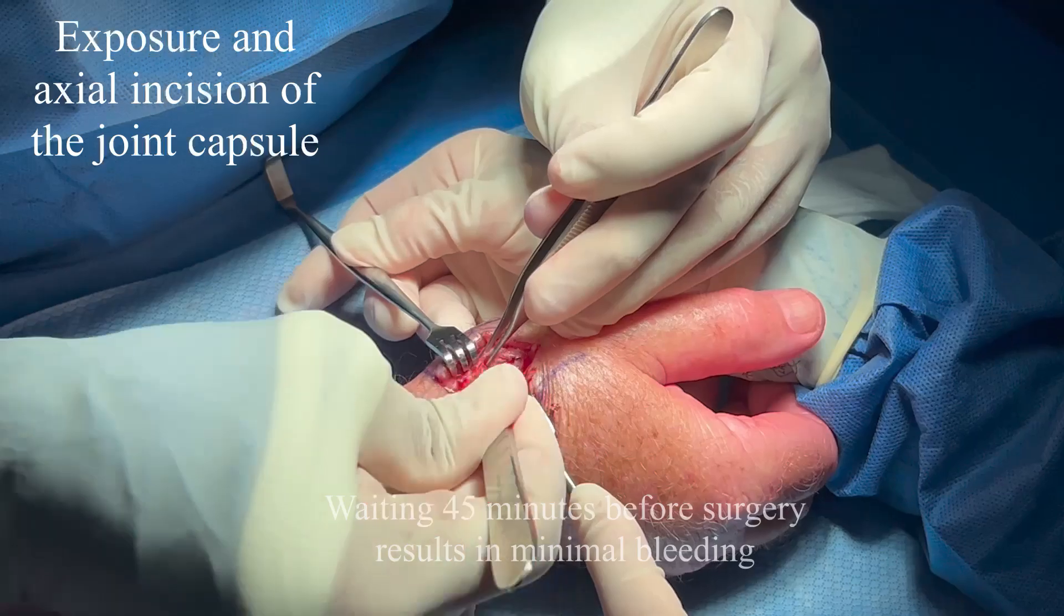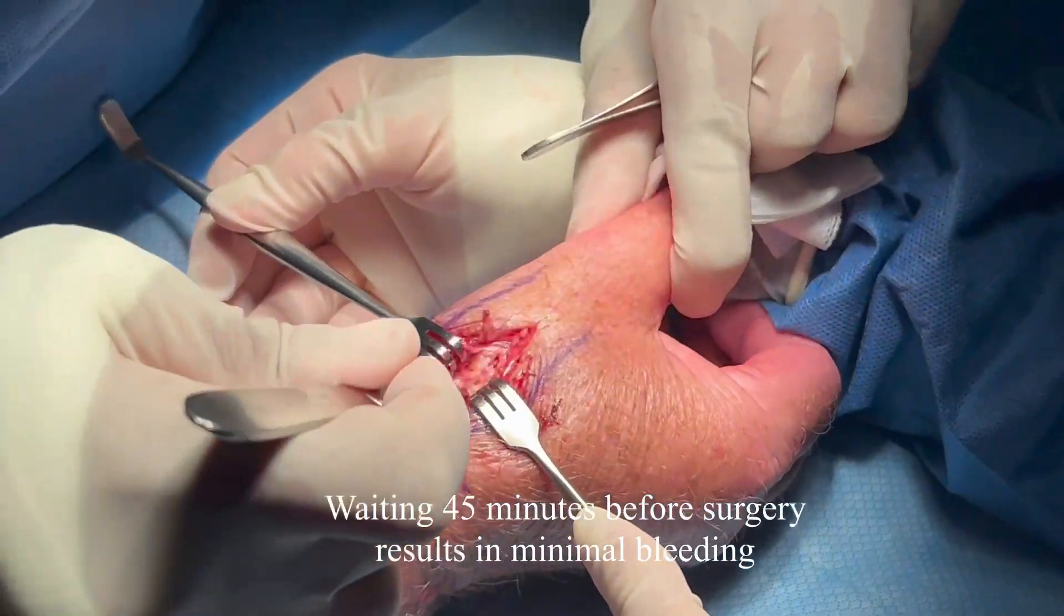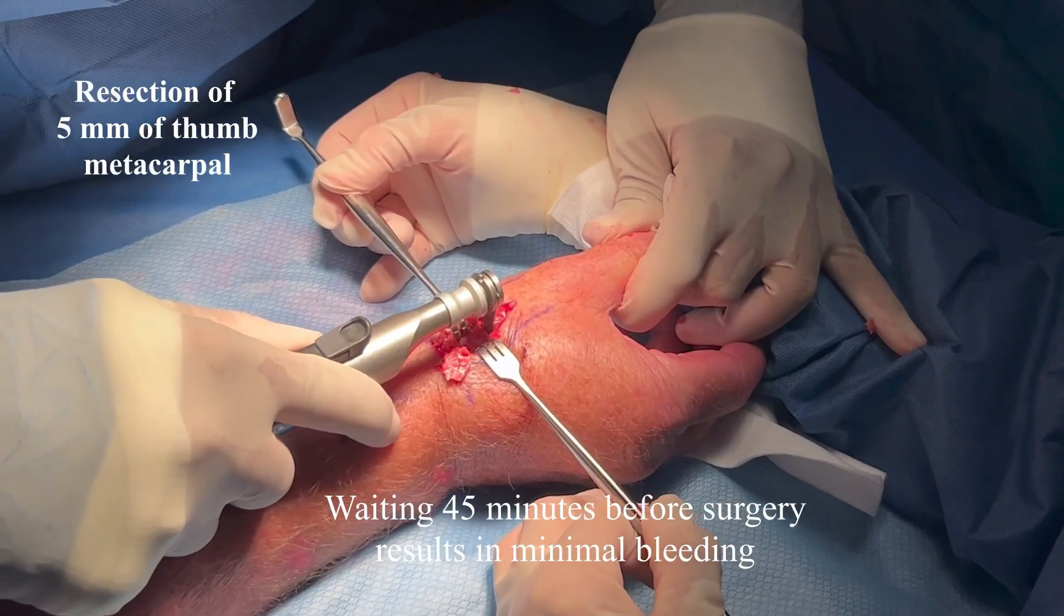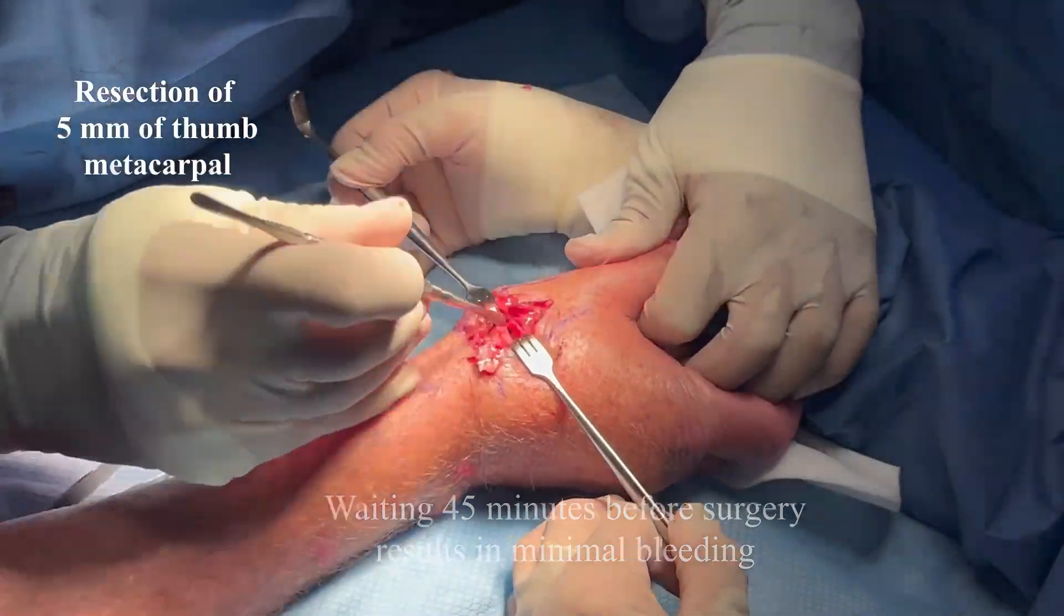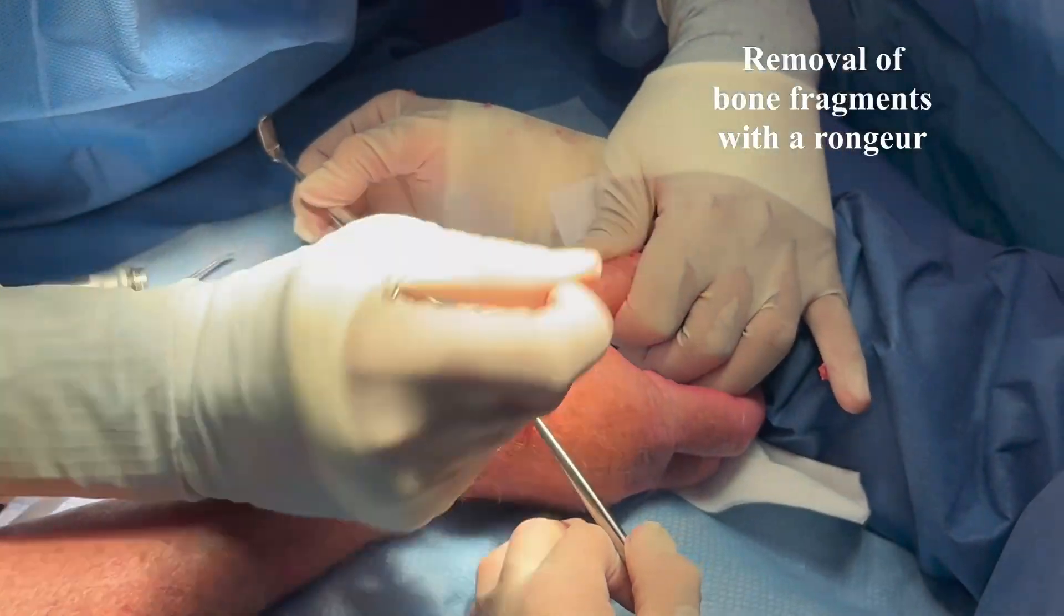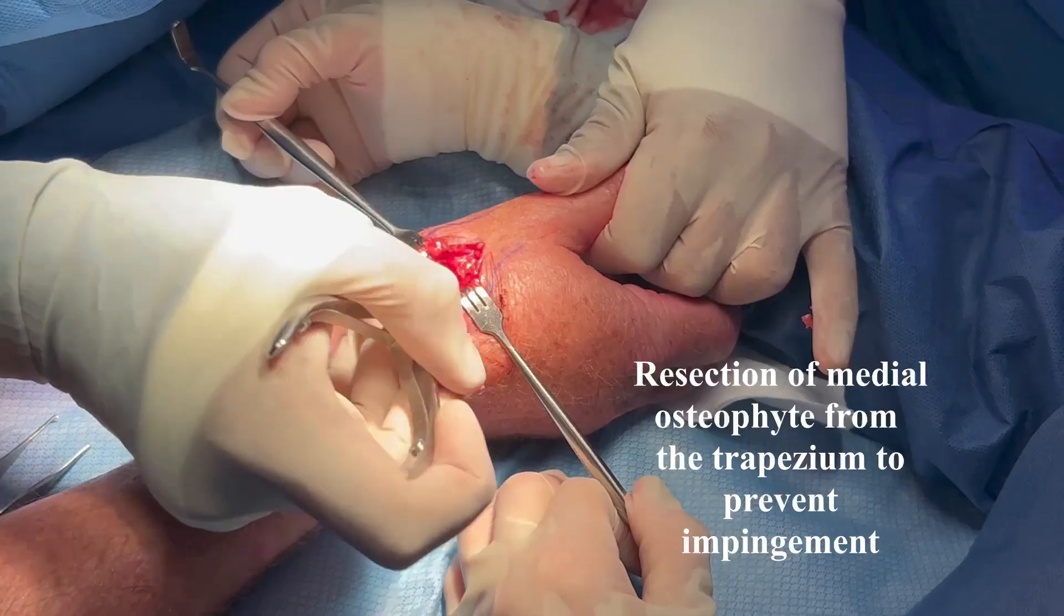The soft tissues are elevated and the joint is exposed. Five millimeters of metacarpal bone are resected with a saw. Bone fragments are removed with a rongeur.